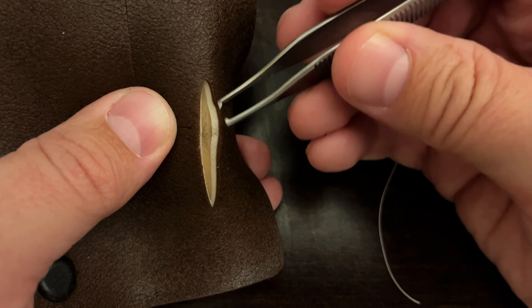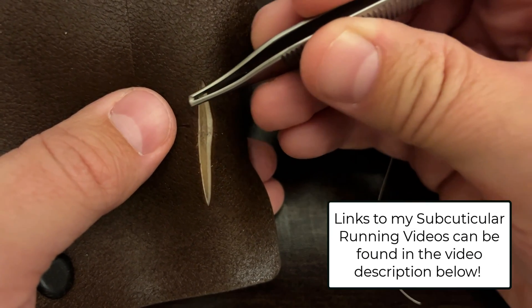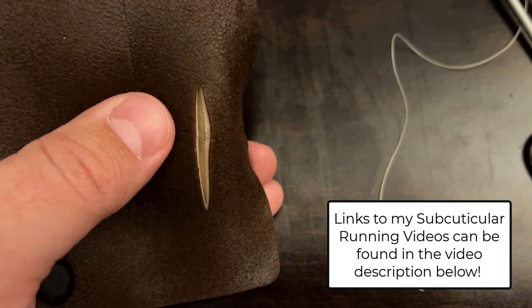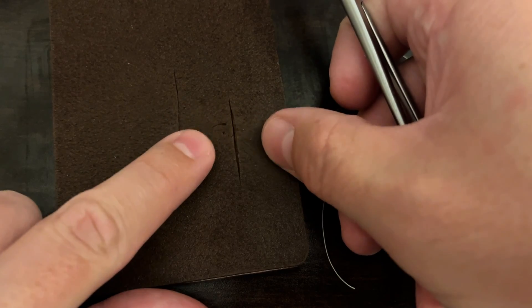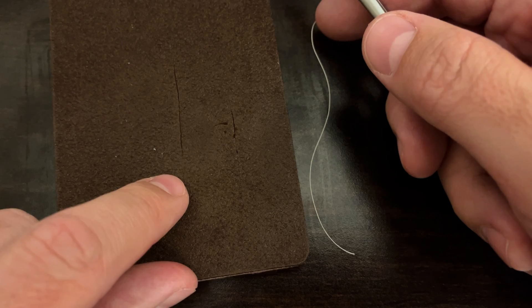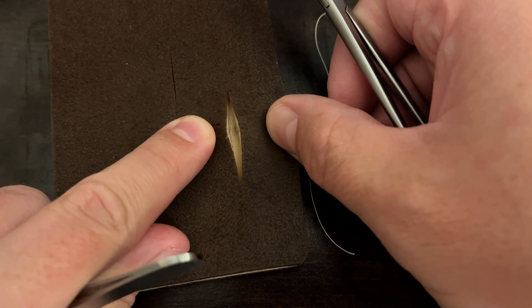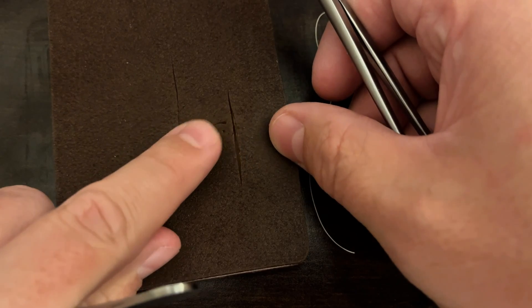If you've seen any of my other videos on subcuticular suturing, there's a running version where you start at one end and do an S-shaped motion back and forth. Notice that I'm doing this lying flat and the skin edges are fairly well approximated — that is important. If you are going to be doing any subcuticular suturing, whether it's running or interrupted like we're going to do today, it's important that you are not suturing skin that is gaping and has a lot of tension.